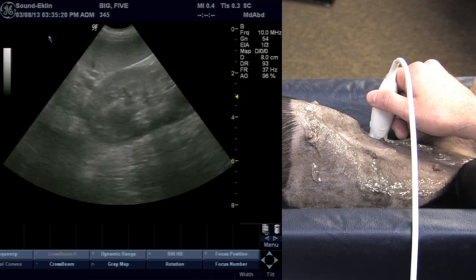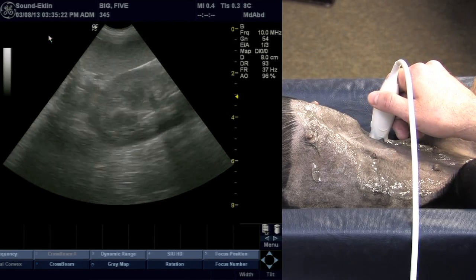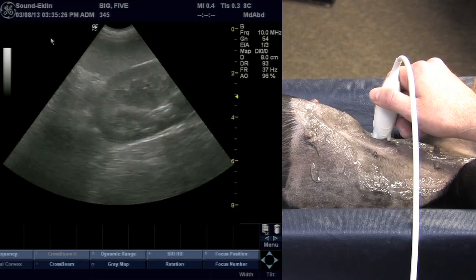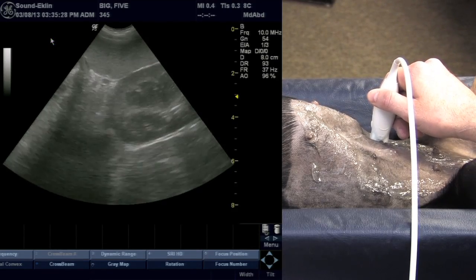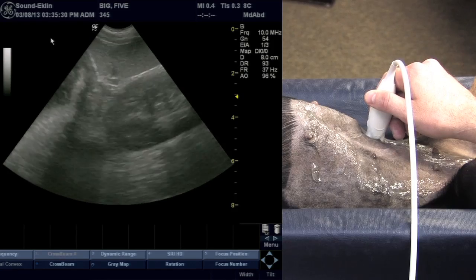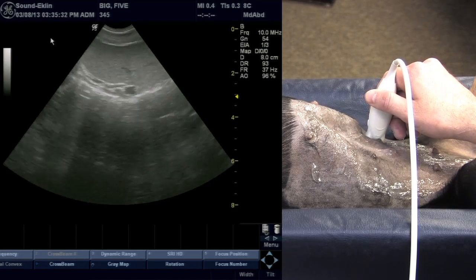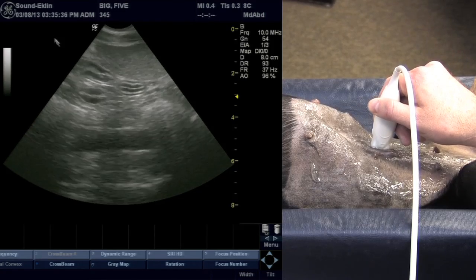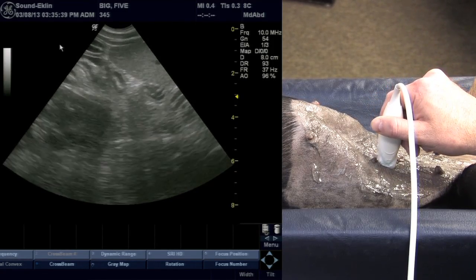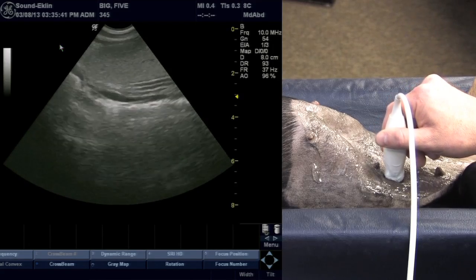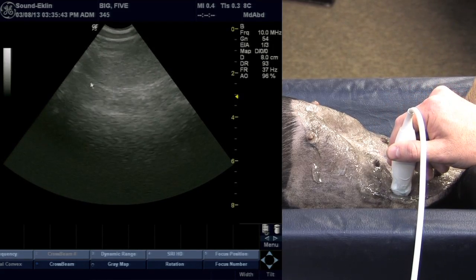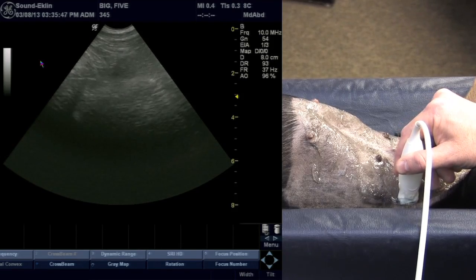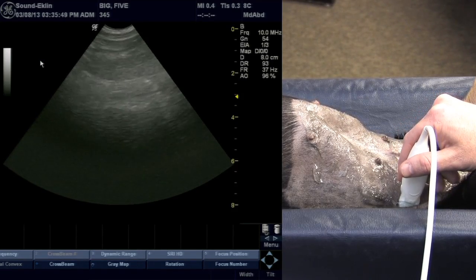Remember that the tail and body of the spleen is variable in its position and location, so this requires you to just move the probe. I typically don't fan — I just slide the probe side to side in what I refer to as a typewriter motion. We're going to slide this probe towards the right body wall, keeping the spleen in the field of view, and continue all the way over to the right side until we run out of spleen.